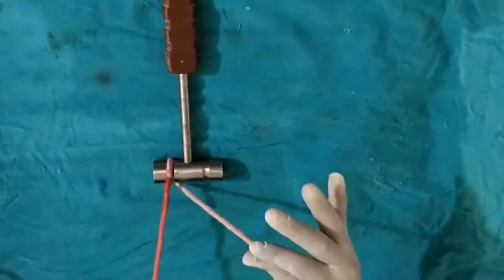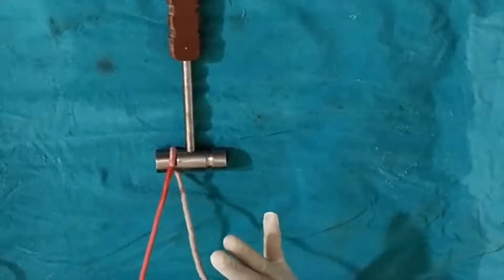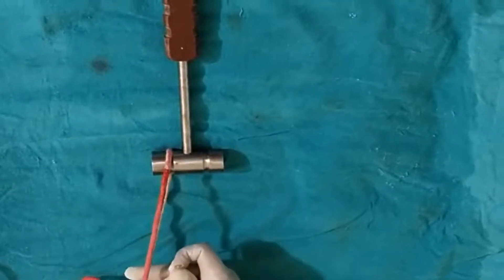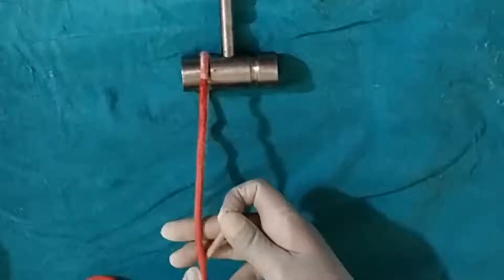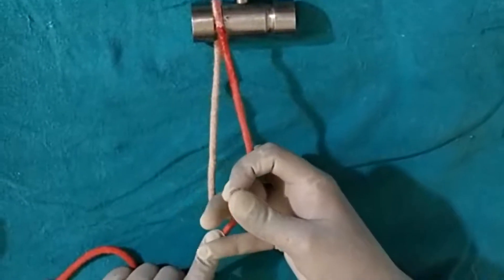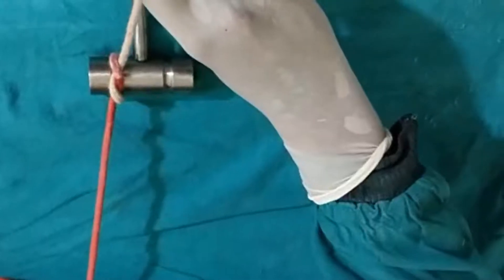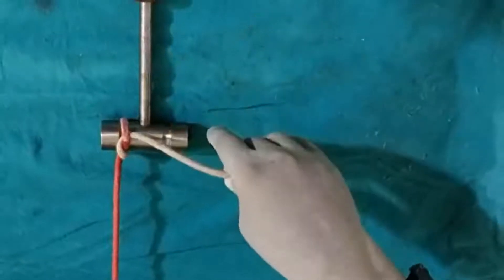For the one-hand tie, hold the free end between the thumb and index finger, then put the middle finger and ring finger over it like this, and then put the long thread over towards the palm side. Then flex the middle finger, hold the free end, and tie. You can see here — this is the first throw.